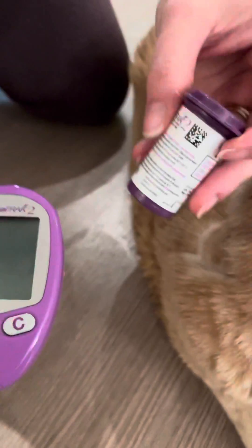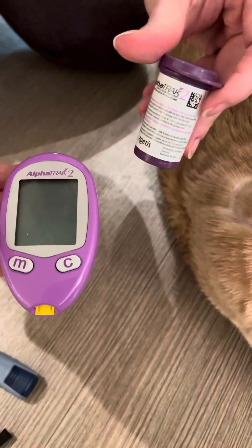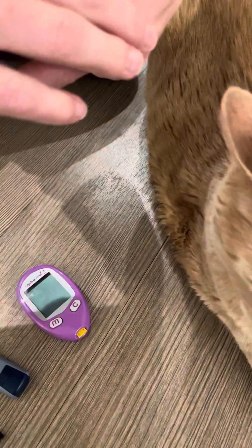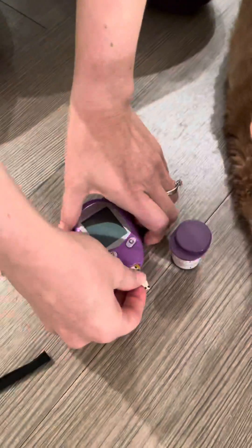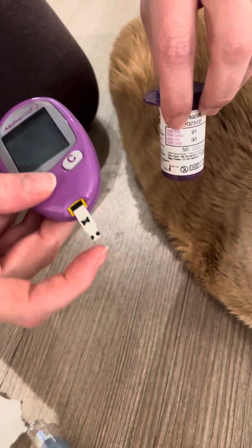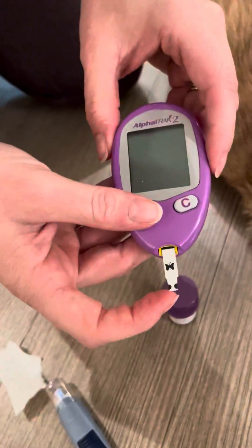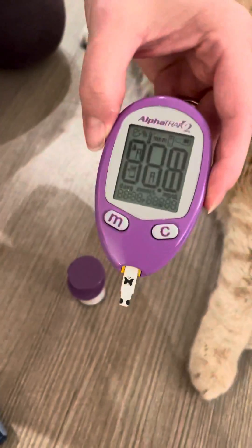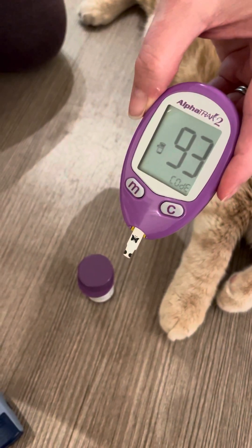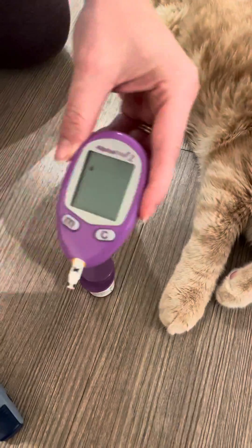This is a video about how to use the AlphaTrack 2 to take glucose on a cat, featuring Hippo the cat. First, you will see that there is a code here for cats, and when you stick in the sensor you will see that it matches that number. You just have to make sure that those match.